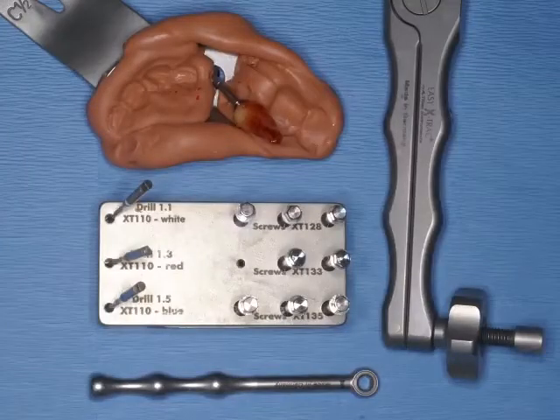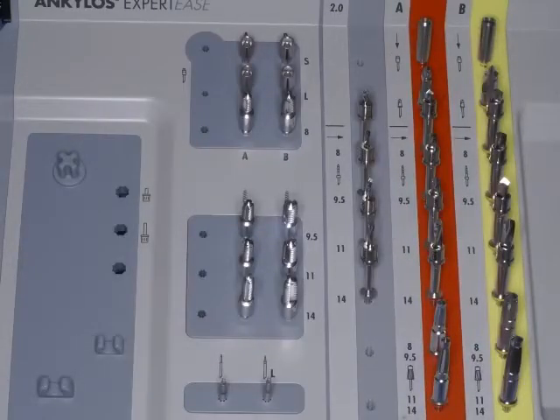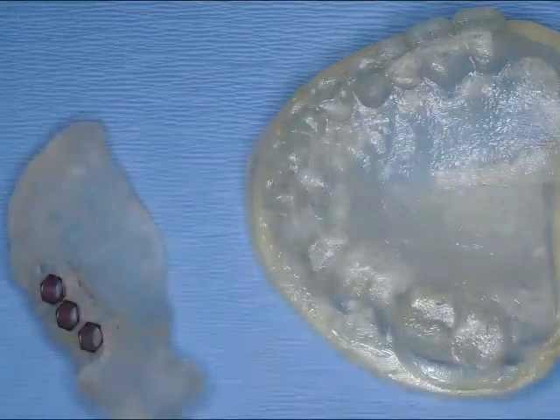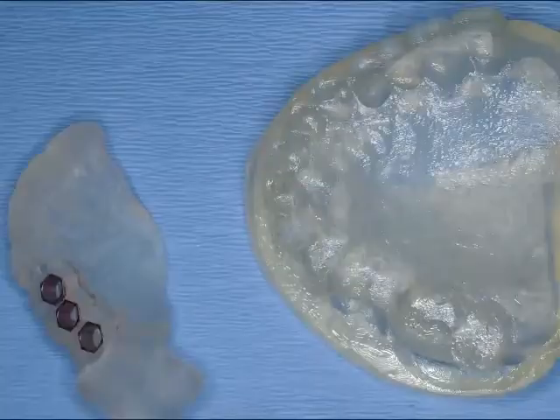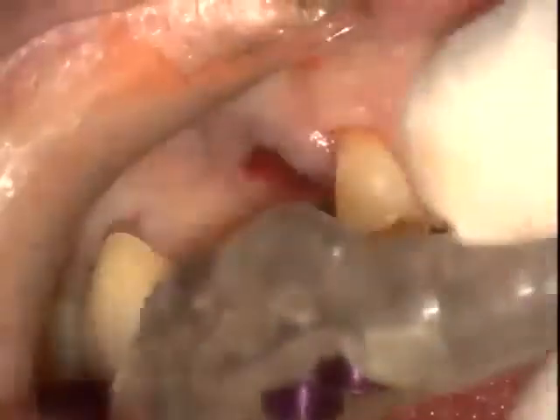And this is the kit that is utilized. It's something that I utilize quite readily on fractured teeth in the aesthetic zone. We're now going to go ahead and proceed with utilizing the Ankylos Expertise Kit, utilizing a stereolithographic rendering of the optical scan model, as well as a surgical guide that was fabricated by Materialise.